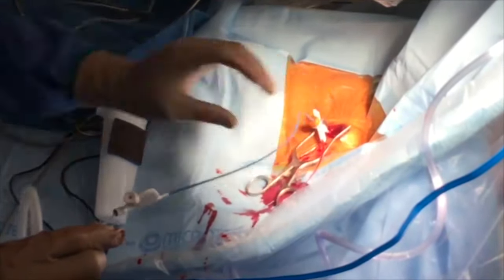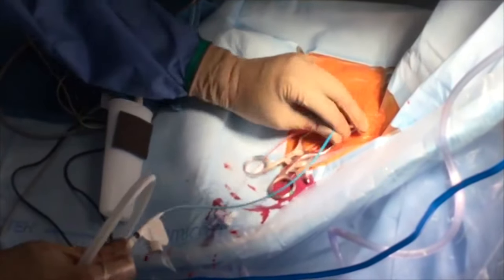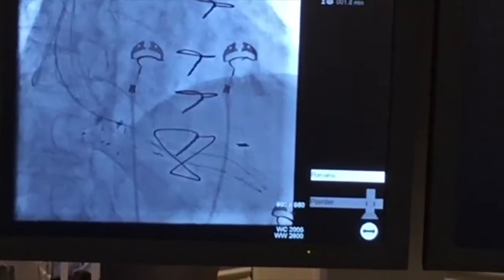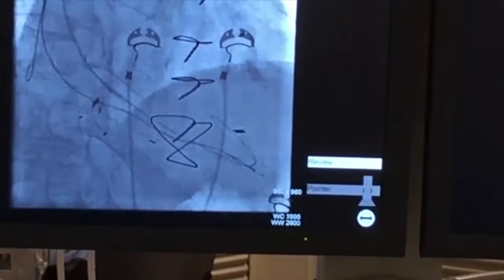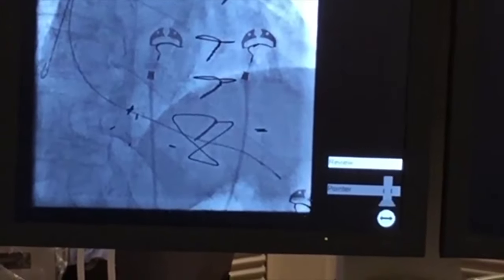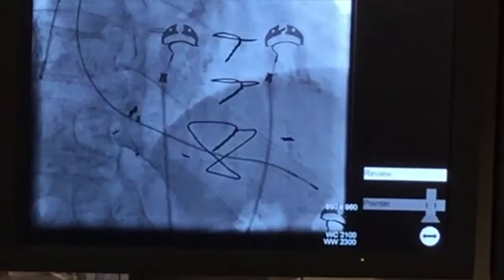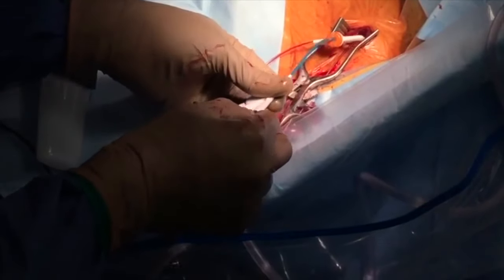Once the sheath is advanced into the right atrium, the dilator and the guide wire are then removed, thereby leaving the distal tip of the sheath either in the right atrium or right past the tricuspid annulus into the right ventricle. The pacing lead is then advanced through the sheath until the distal tip of the lead is exposed outside of the sheath near the tricuspid annulus. If the lead tip is in the atrium, gentle advancement of the sheath with clockwise rotation can help reach the his-bundle region. Likewise, if the lead tip is in the ventricle, gentle pullback with counterclockwise rotation can help reach the his-bundle area.